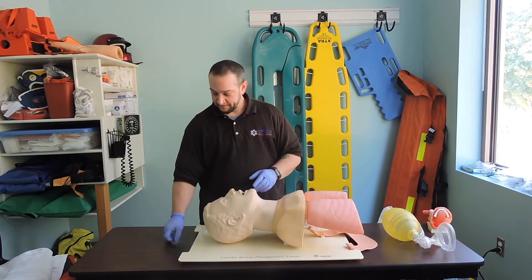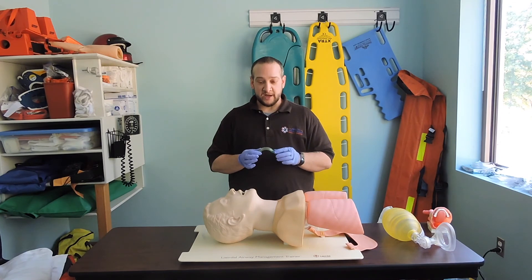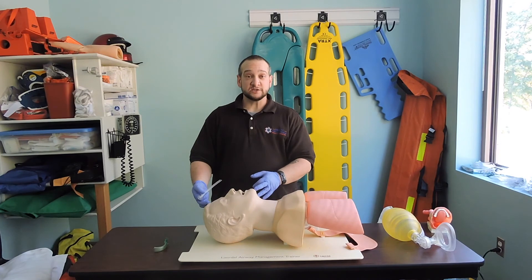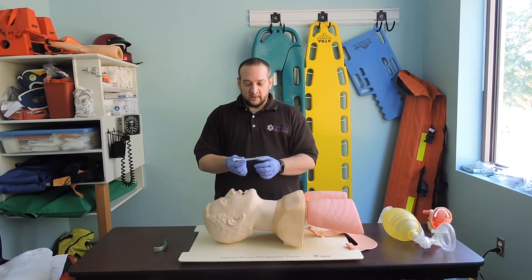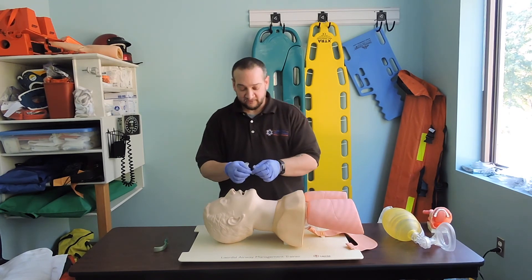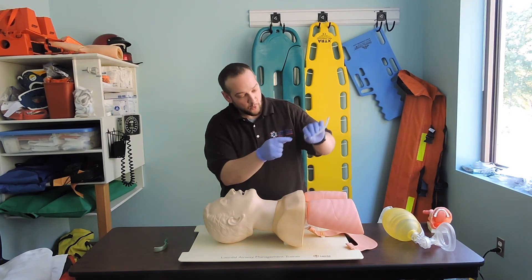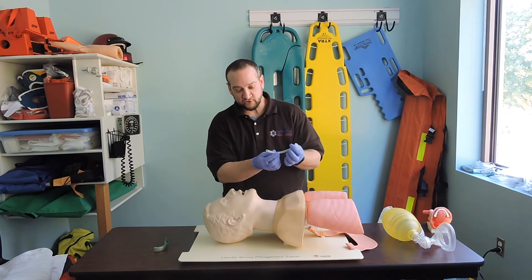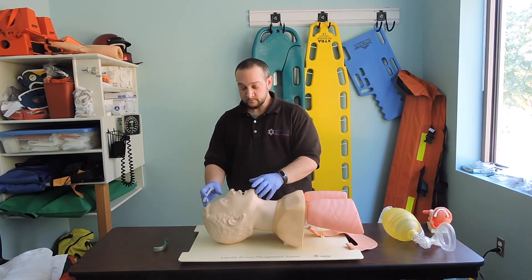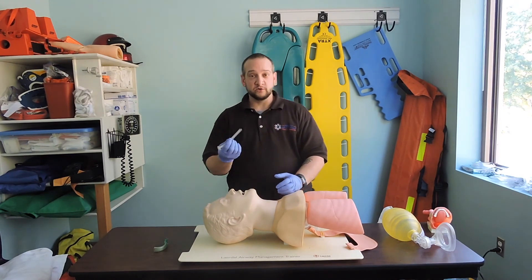The OPA is for an unresponsive patient who does not have a gag reflex. If the patient does have a gag reflex or is semi-conscious, then I'm going to use my NPA — nasopharyngeal airway. This adjunct is soft and flexible with a beveled end, and the other end is a trumpet flange. Same as the OPA, I'm able to ventilate through the fenestration of the device.